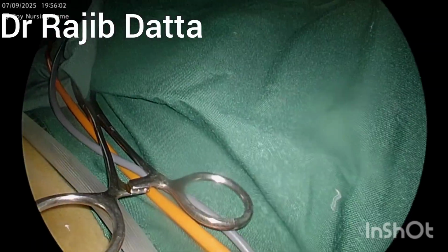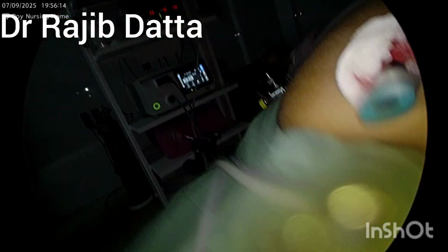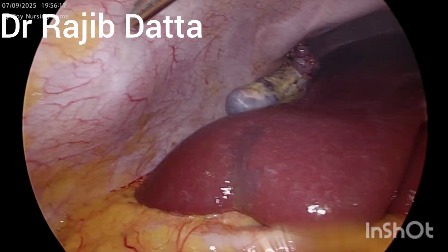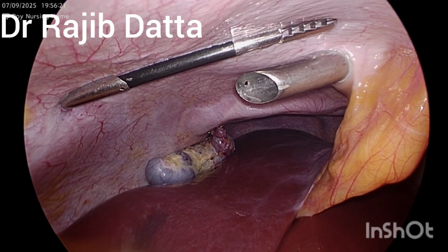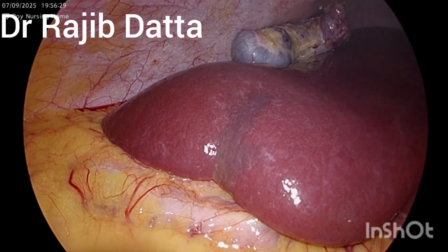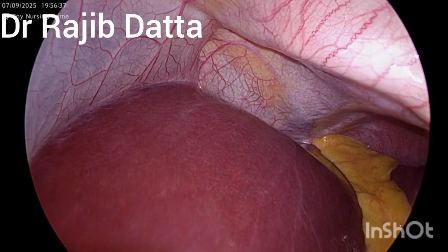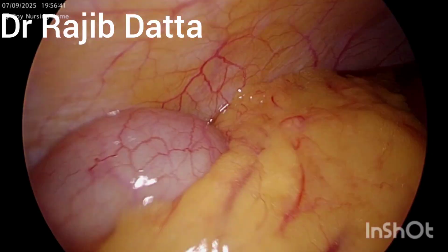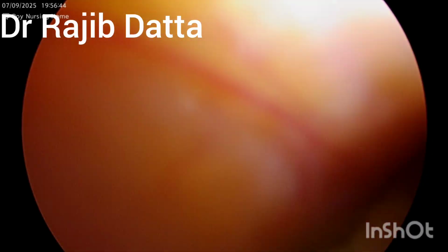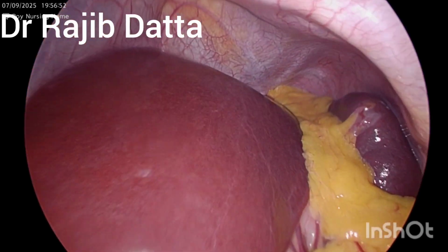That means gamma glutamyl transpeptidase will be raised in this kind of patient. And so our gallbladder has been separated enough, and the next job is application of the endobag, so that the gallbladder can be well preserved in the endobag, and we will retrieve it.